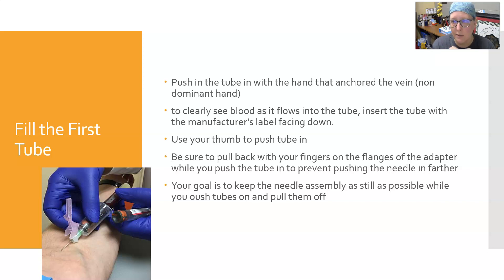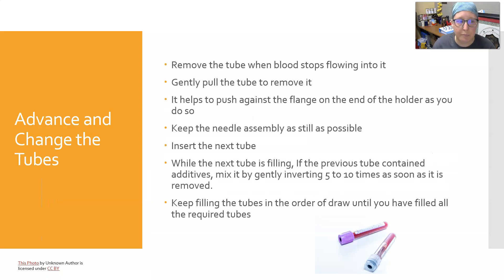The point is to keep the needle as still as possible and in the vein so you can push tubes on and off the needle assembly without moving the needle in the patient's arm and losing your position. Remove the tube once blood stops flowing into it — that means the vacuum has pulled the adequate amount of blood. Make sure it filled up correctly. Gently pull the tube to remove it, pushing against the flange on the end of the holder as you pull. Keep the needle assembly as still as possible, then insert the next tube.